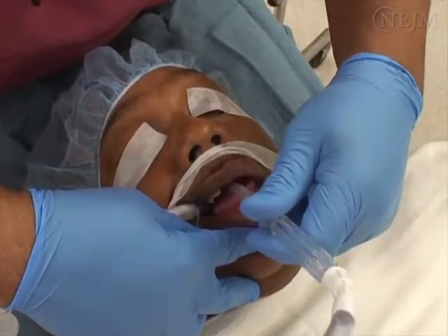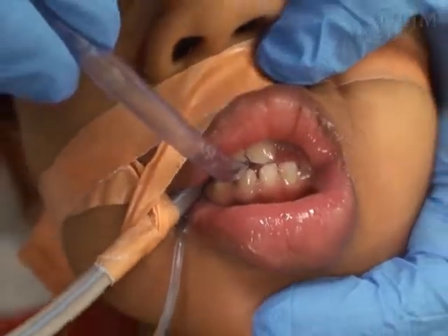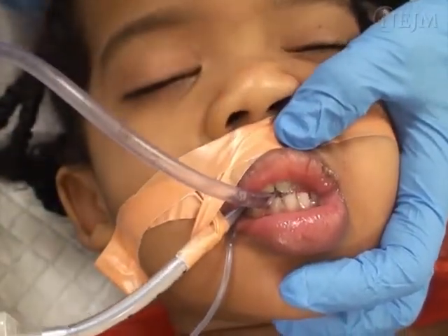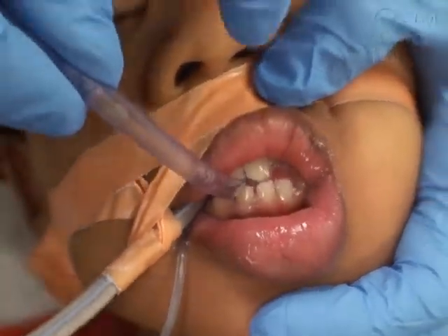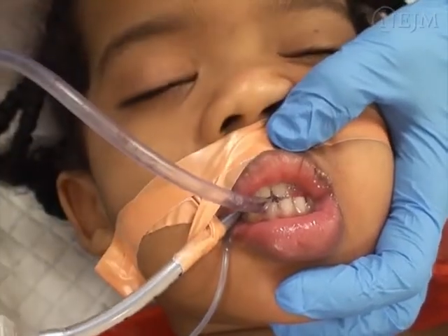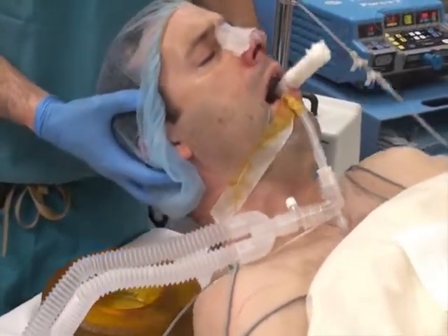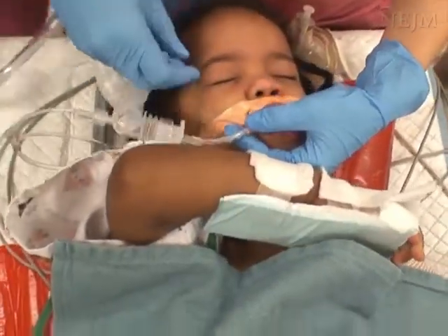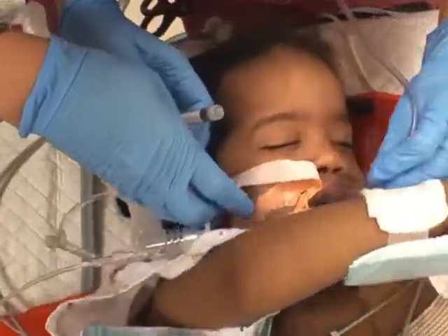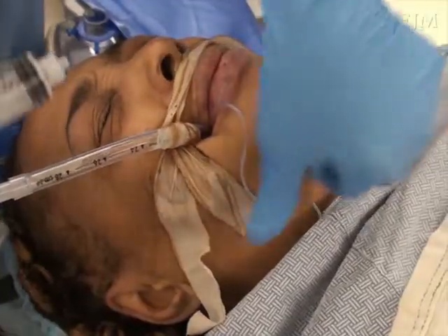Carefully suction any oropharyngeal secretions, avoiding direct dental or airway trauma. To minimize the risk that the patient will bite the endotracheal tube, which could cause occlusion of the tube or result in dental injury, a bite block or an oral airway can be used. If the endotracheal tube becomes acutely occluded, negative pressure pulmonary edema may develop, in which case extubation would need to be postponed. Patients emerging from general anesthesia often make forceful, uncoordinated movements just before they are ready for extubation. Therefore, it is vital to protect the position of the endotracheal tube to keep the patient from accidentally self-extubating, which could cause hypoxemia. In addition, the patient's fingernails or objects such as the pulse oximeter could cause abrasions to the corneas if the arms and hands are not secured.